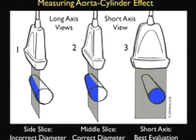As shown in probe position 2, by moving the probe into the middle slice, we can get a correct diameter, but you must be sure that the probe is positioned towards the midpoint of the aorta, and this can be somewhat difficult in the long axis orientation. Thus, most authorities would recommend that the short axis configuration is the best way to truly get a sense of the diameter of the aorta. Let's look at probe position 3 all the way towards the right of the image here.